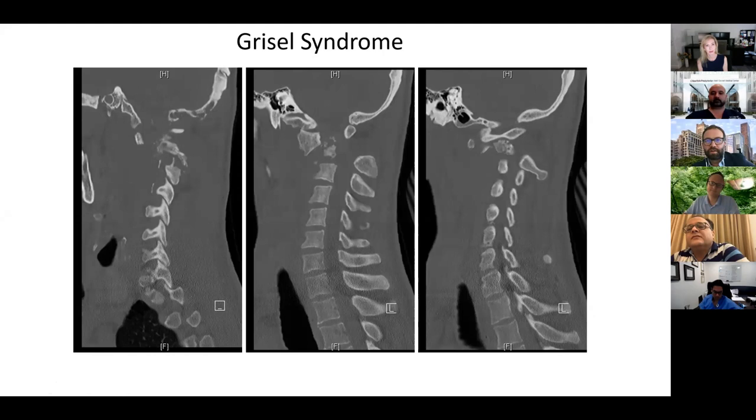And you can see here, that's the foramen magnum right here. And you can see here's the opisthion. And it's rotated. This is totally rotated along with C1 over C2, subluxed forward as well. And there's a significant deformity at the craniovertebral junction. You can definitely see it explains the symptoms. That's why the patient's weak in the upper and lower extremities.